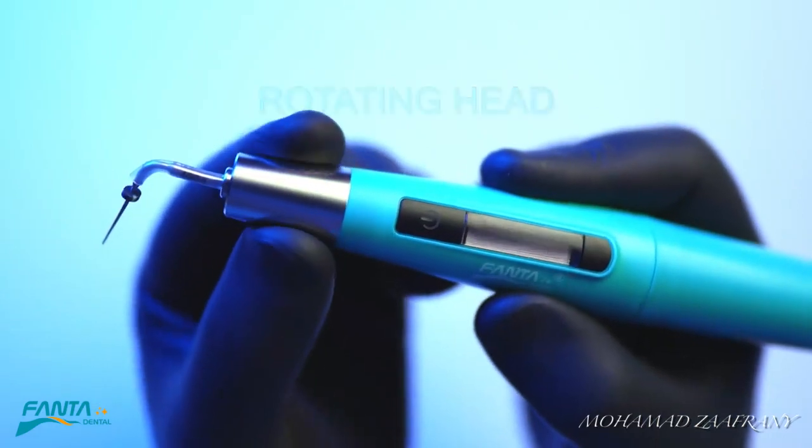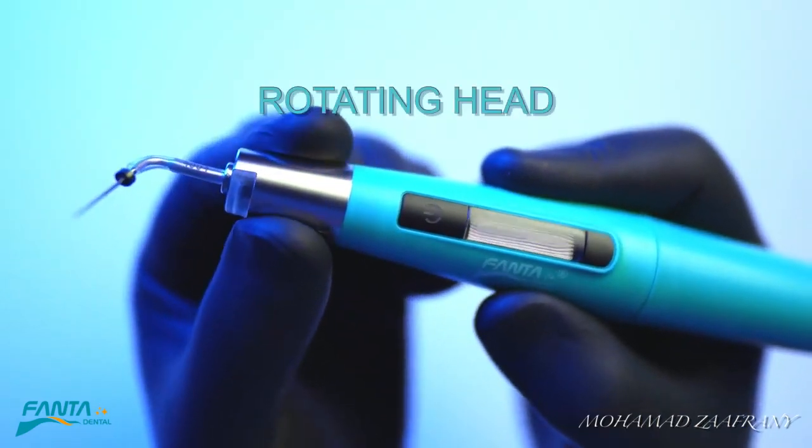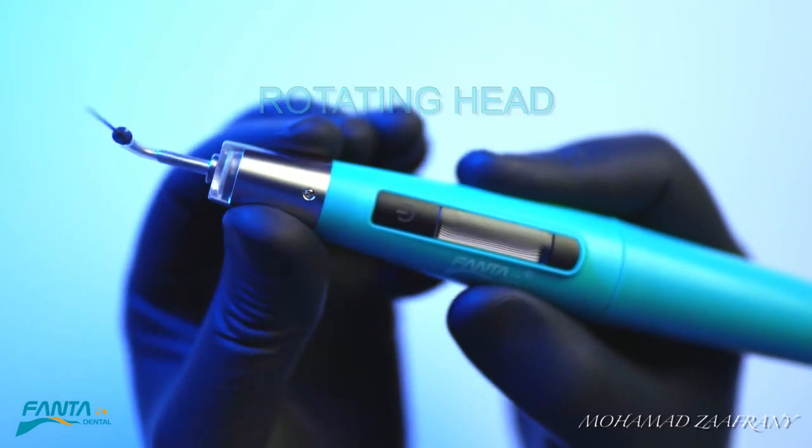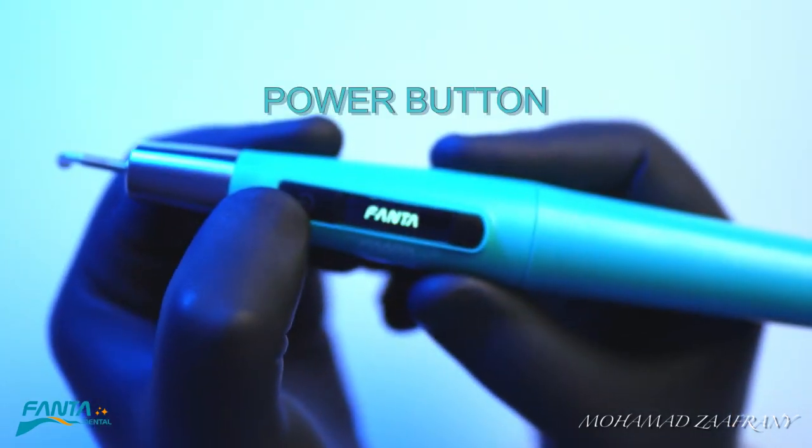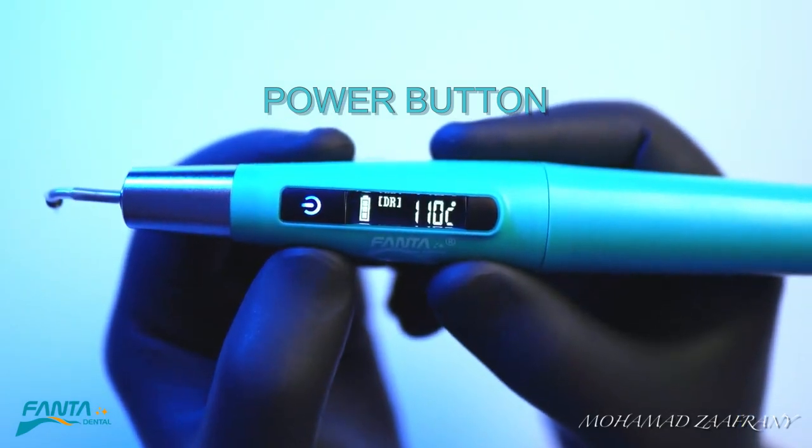The head of the device is a rotating head, so it can fit different clinical situations. Once you push the power button, the device is ready to use.